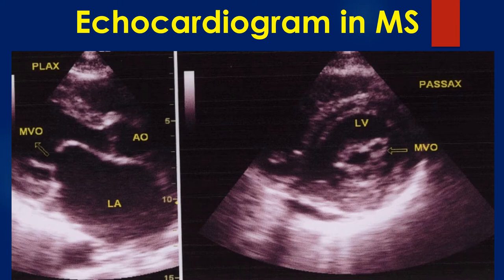Parasternal short axis view is used for quantitating the severity of mitral stenosis by using planimetry to measure the mitral valve orifice. Commissural fusion and calcification, if present, can be seen well on parasternal short axis view. Transmitral gradient is better assessed in apical four-chamber view by Doppler.